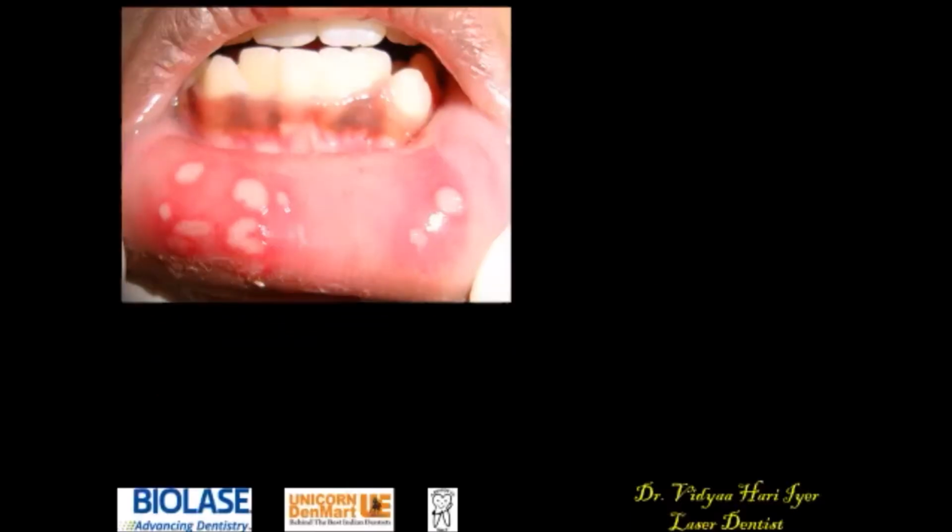Now I'm going to show you some clinical cases just to give you an idea why we use lasers and what the benefits of using lasers are. So here is a patient, a young child, and you can see he's got oral ulcers, as we call them, and these ulcers are quite painful. When you see such patients, you will understand that they have difficulty in eating their food. They will have even difficulty in movement of their lips and even talking at times. So we need to be very careful that we give treatment immediately.